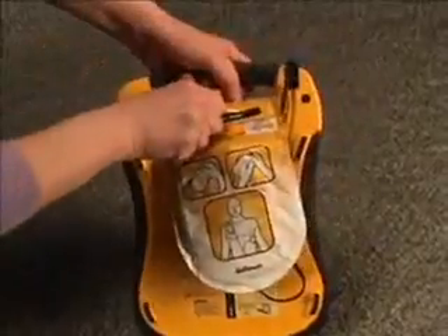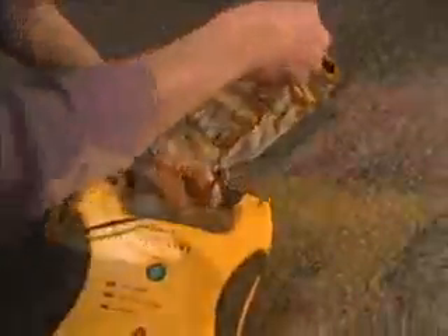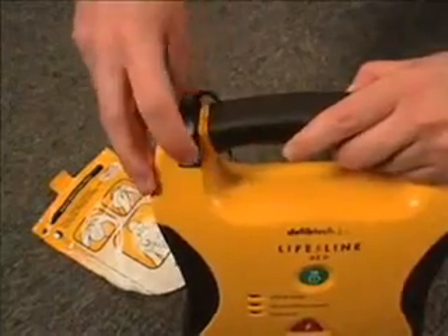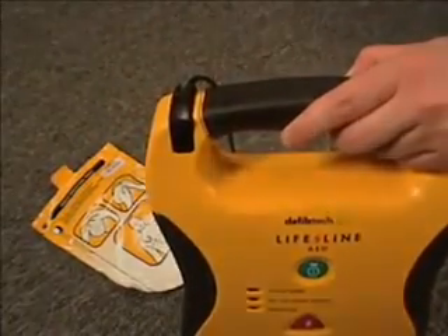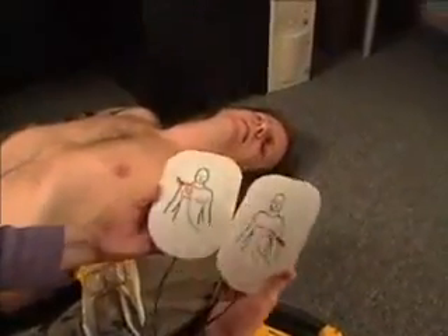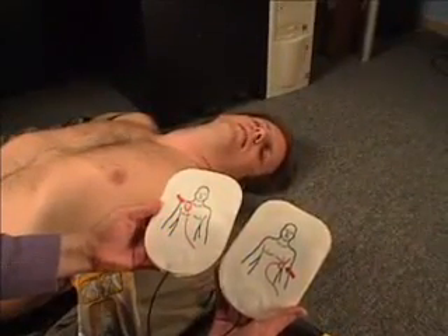Remove the pad package by pulling on the tab on the pouch. If the pads are not already pre-connected to the unit, connect them by inserting the pad connector into the top left corner of the AED. Remove the pads from the package by tearing along the dotted line and follow the instructions printed on the package. Make sure the victim's chest is exposed and dry. If needed, shave the victim's chest hair. Place the pads on the victim's chest according to the diagrams on the pads.